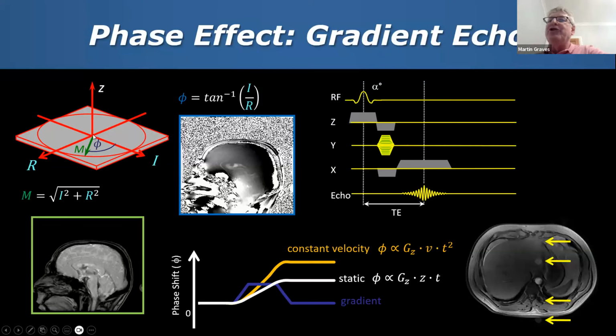Now, the vast majority of the time, we simply calculate the magnitude. So all of our standard MR imaging is primarily looking at the magnitude of this complex data, the length of that green vector there. So that's simply the imaginary squared plus the real squared, all square rooted. We get a very nice standard image.